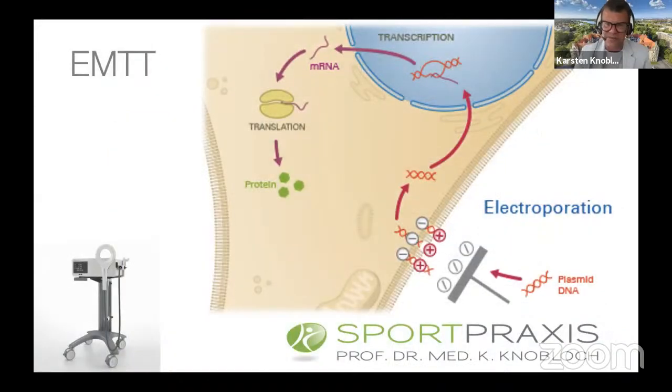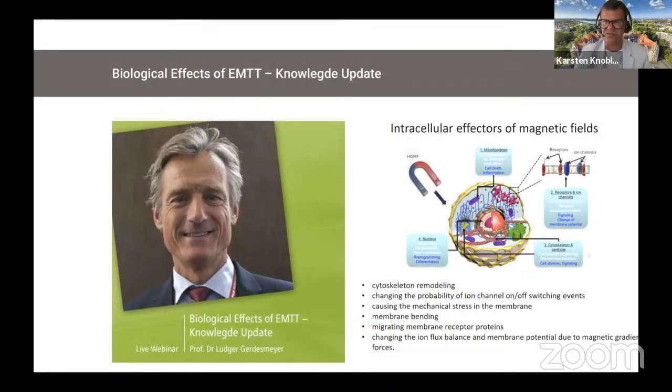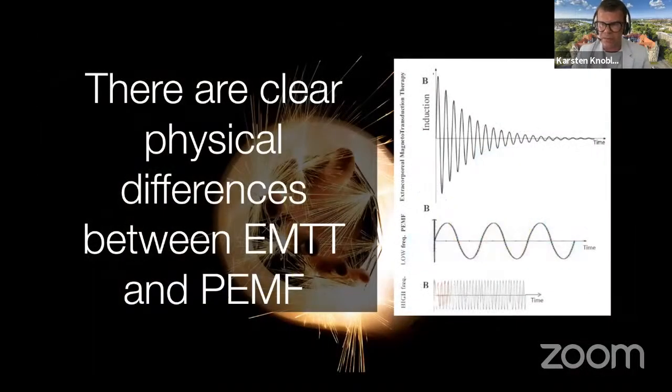And as Daniel pointed out beforehand, it is supposed that EMTT is working on one mechanism called electroporation, and Daniel has shown it beautifully in the non-union as a source for bone healing, is a so-called piezoelectric effect, which stimulates bone healing. So in the end, as of now, in the year 2021, I believe that there are some intracellular and even membrane-located effects by which these pulsed electromagnetic fields may cause some action.